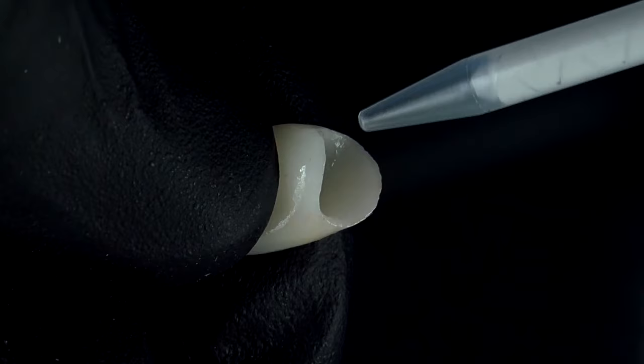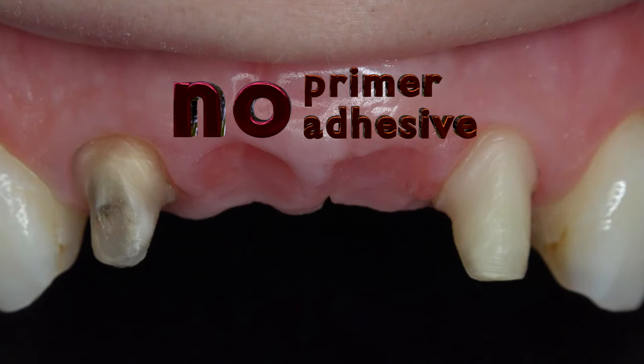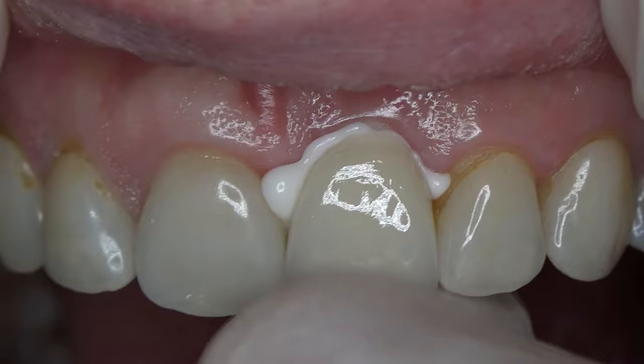Mixing ratio is very important in resin-based cements, therefore using auto-mixing systems becomes important as well. Since neither the silanization of the restoration nor the use of primer or adhesive on the tooth are required in resin-modified glass ionomer cements, their practical use and moisture control remain at the forefront.